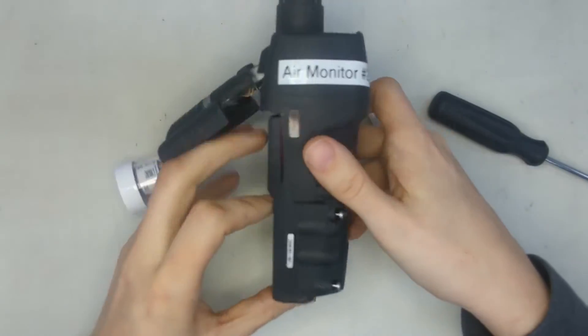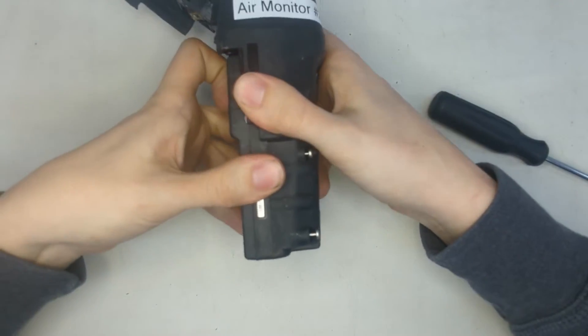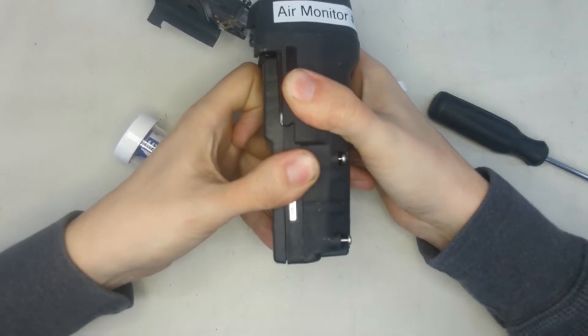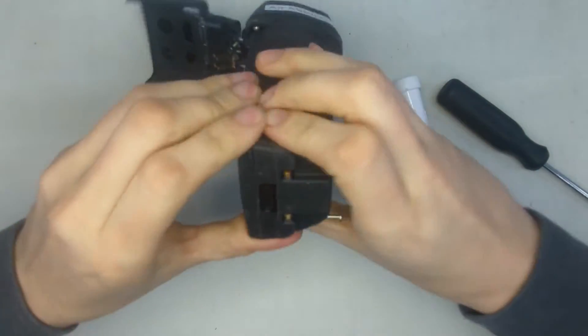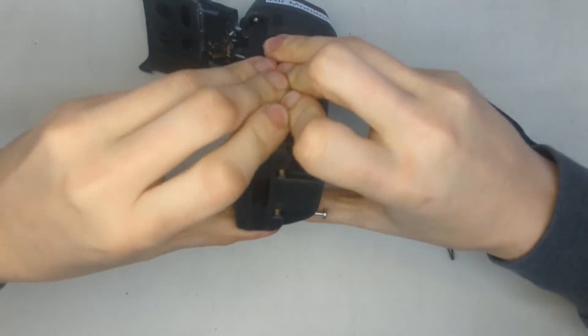I'm going to unscrew the four screws in back here. Okay, now we've got the screws out. I'm just going to pull the unit here straight out. Now the first time you do it, it might be a little difficult. You might have to pry it just a little bit.